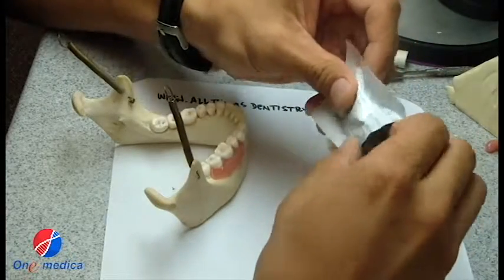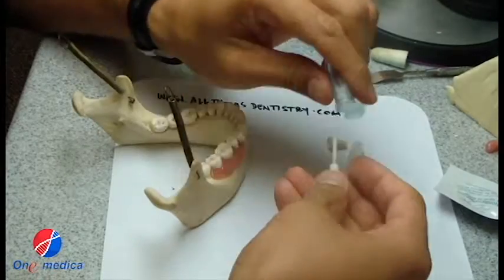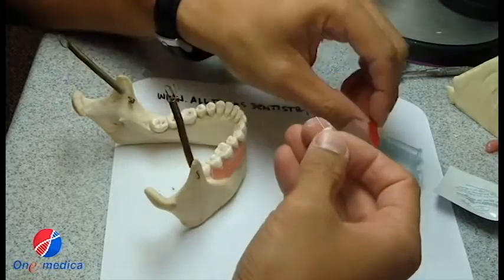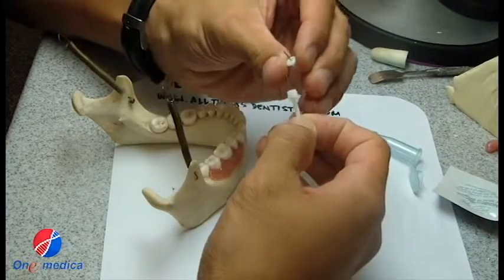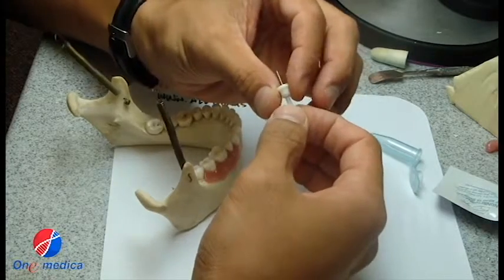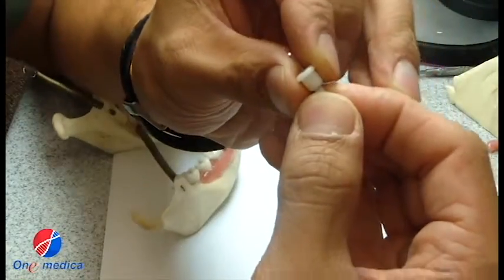Now, here it is, a little piece. Check out my blog on symptomatic irreversible pulpitis and the algorithm. This is in there, and here it comes with the perforator and then the sleeve. Just pulled it out. But it's important to make sure that this is going to come off. Now, I'm going to stop talking and I'll let you listen to this.